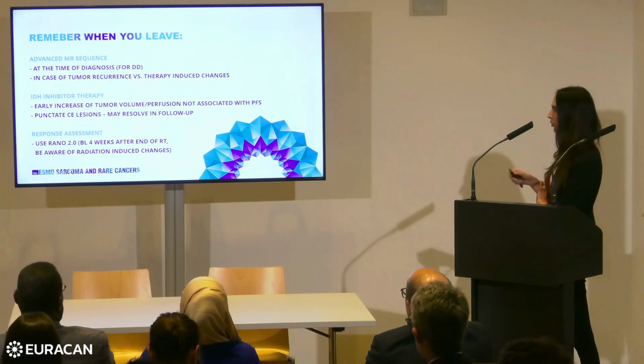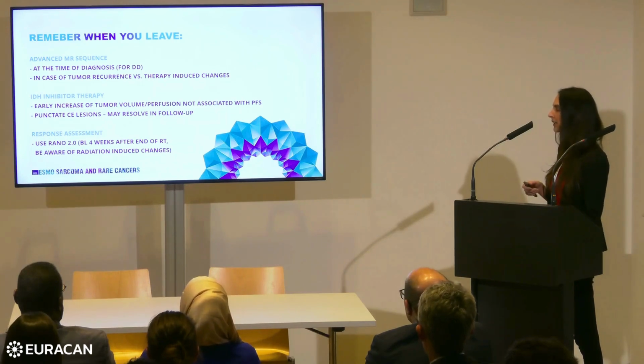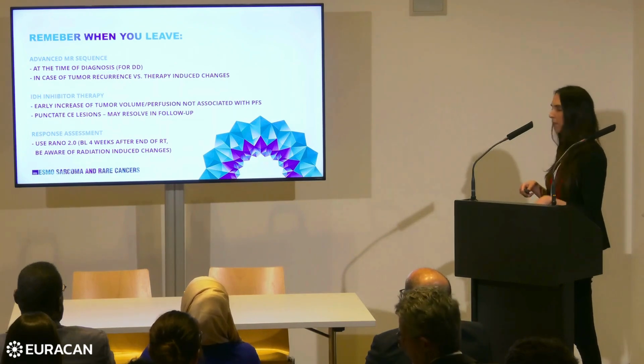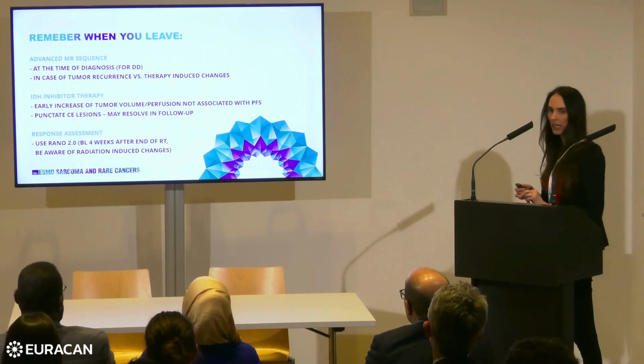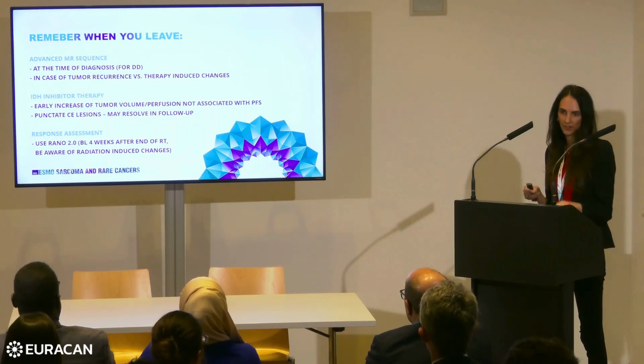And when it comes to response assessment, now use the RANO 2.0 criteria. Be aware that you implement the baseline MRI scan 4 weeks after the end of radiotherapy, and be aware of the radiation-induced changes at this time point.